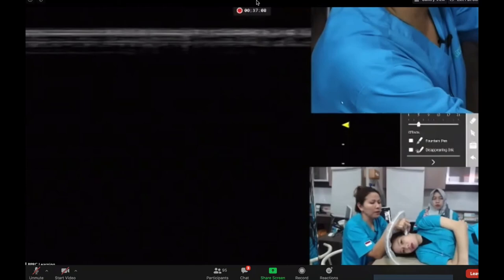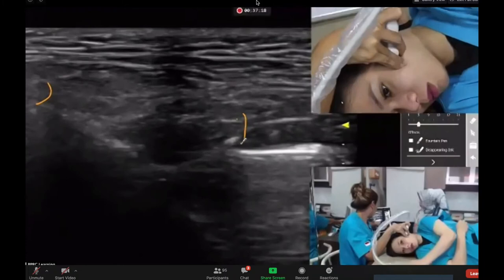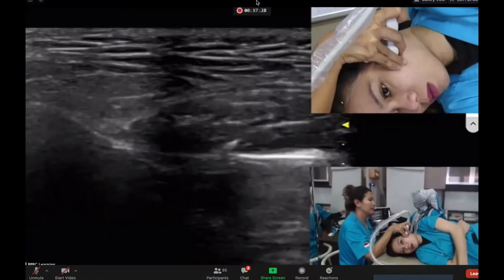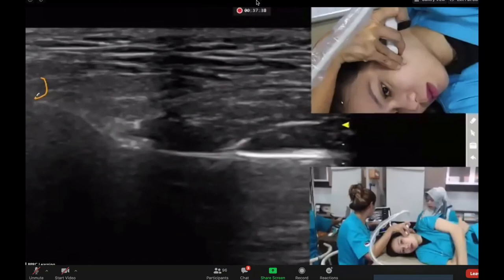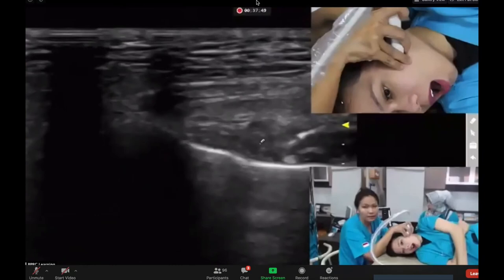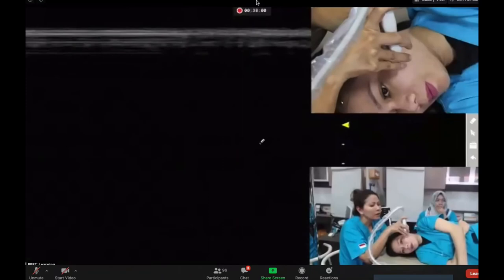This is bone, right? At the left side is the temporomandibular joint here, and this is the... moment, please. Okay, this is the joint, a shadow of the joint. And this is the shadow of the joint, and this is the bone of the coronoid process. Okay, this is all covered with bone. So what I want to do is ask the patient to open the mouth. See? Wait a moment, please. Close. Okay. Still not. Oh, wait. This is the gap.